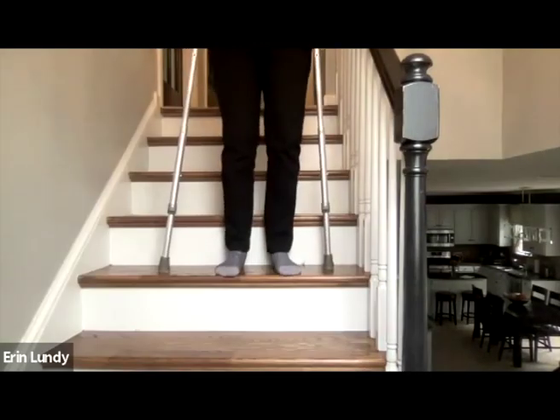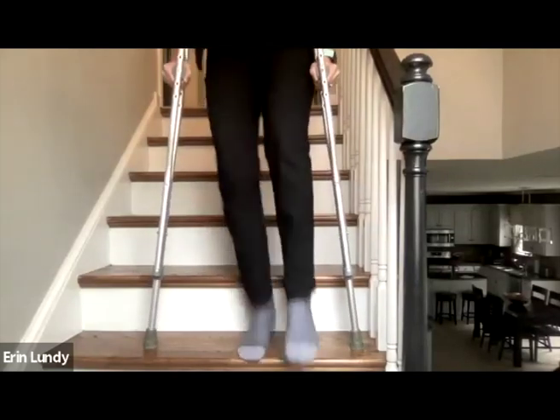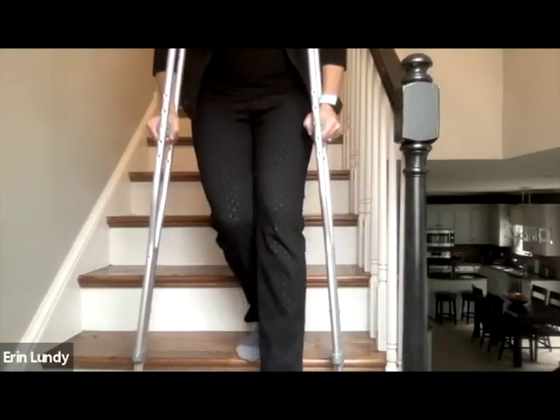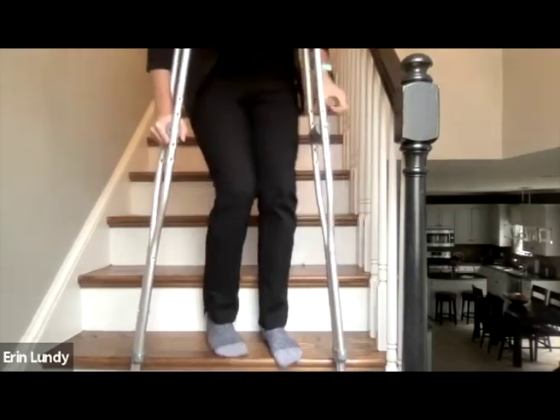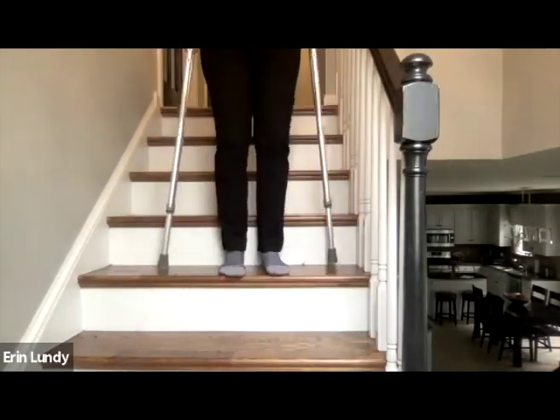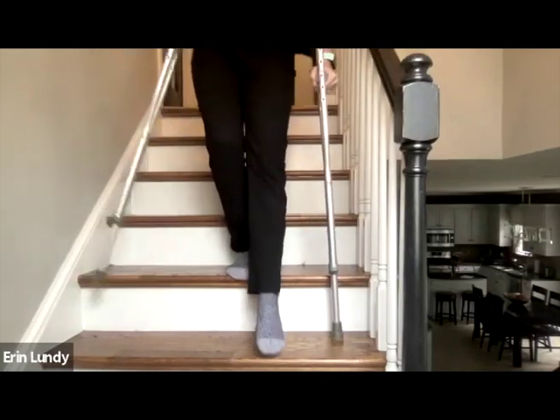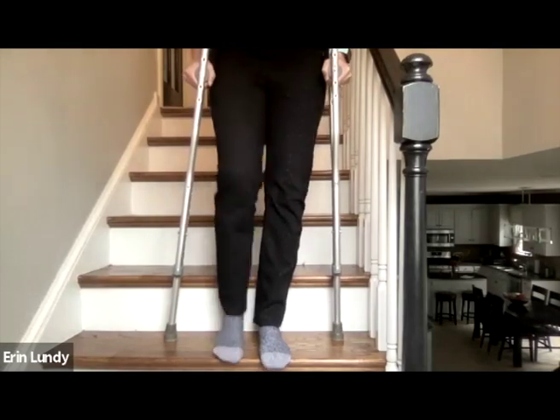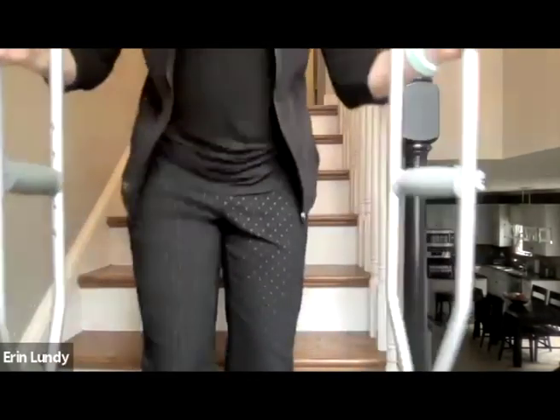So you're going down the stairs and you're told not to put any weight on your left leg. Crutches down, crutches down. However, if you are able to put weight through your leg, what you're going to want to do is lead with your injured leg first. So crutches together. The little mnemonic is up with the good, down with the bad. So whenever you're going down, lead with your bad leg, or you're going up, lead with your good leg.